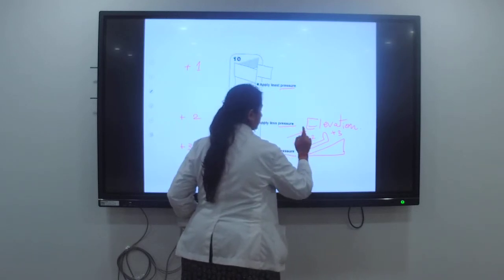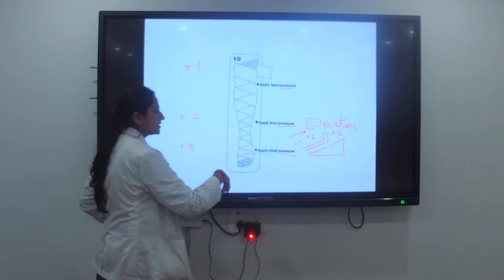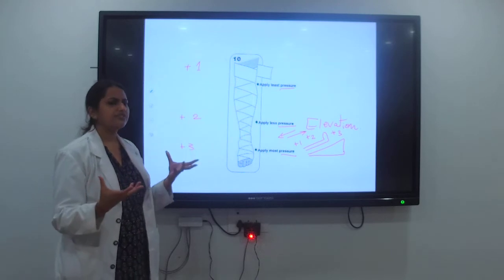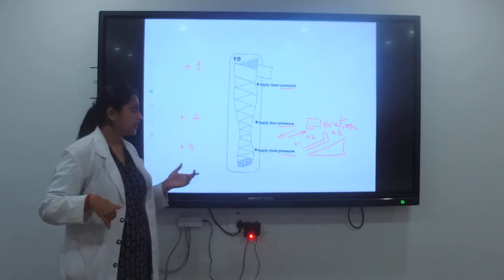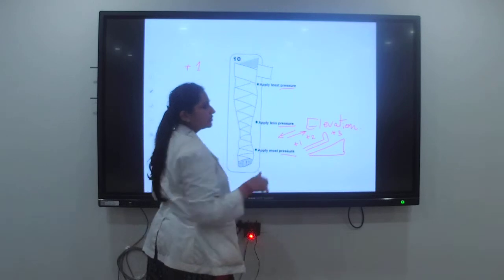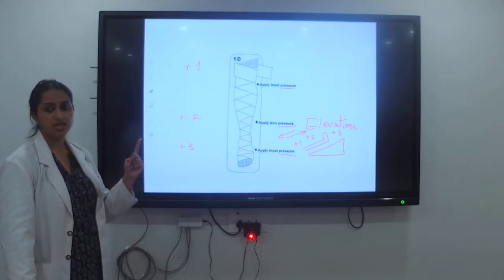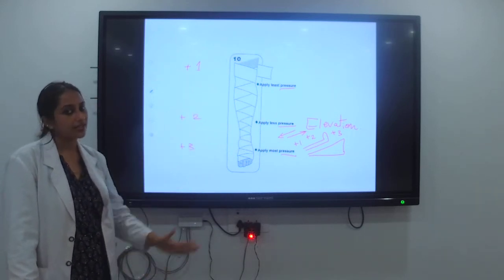So when the edema starts decreasing, what will happen? The edema will start flowing towards the ankle, towards the knee or towards the nodes. While it is flowing, if the pressure is not enough, it will start to revert back towards the foot. So the elevation is there so that the edema will drain. Even so, if the pressure is high towards the foot, do you think the edema will revert back towards the foot? No, it is not possible. Why? Because it is elevated and the pressure is also high. So the edema will drain from the highest point to the lower, but from the lower to the highest point, the edema cannot revert back.